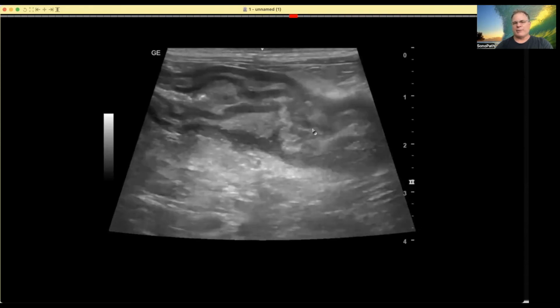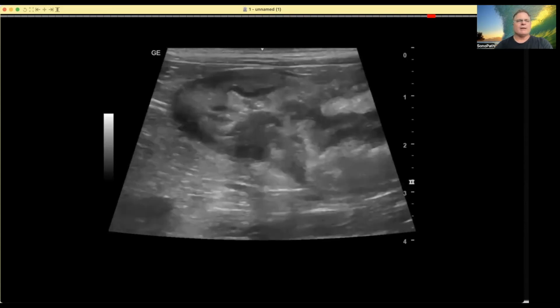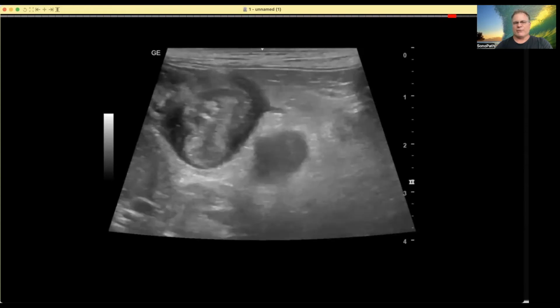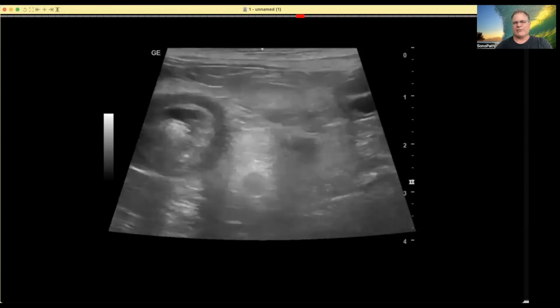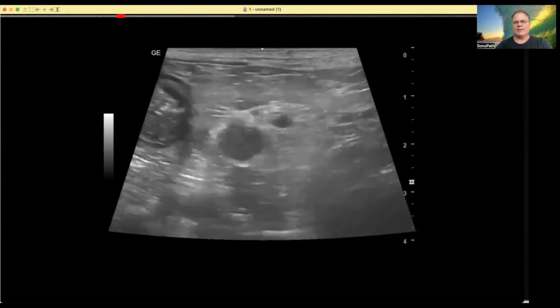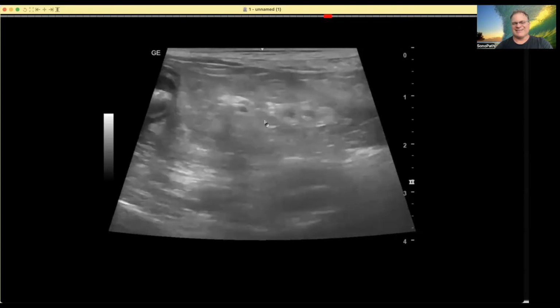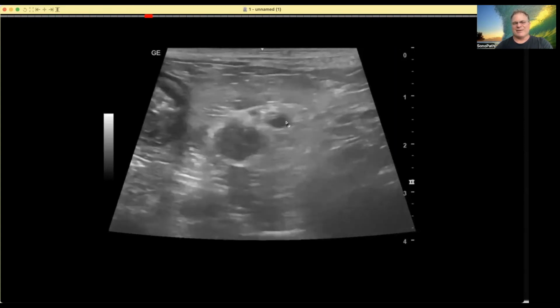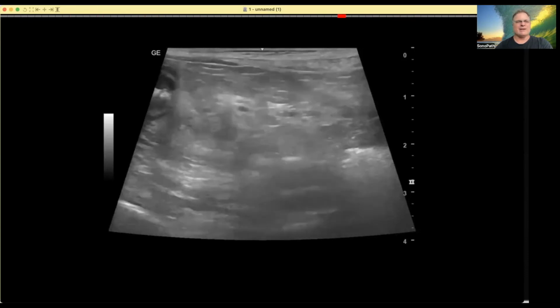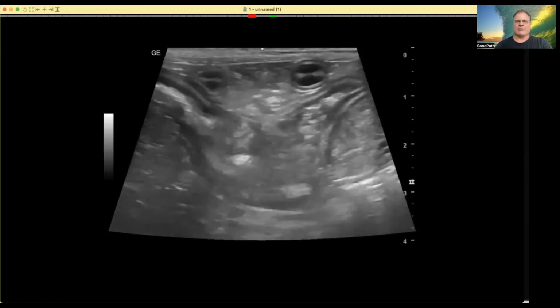Maybe it moved on through and it's elsewhere and created all of this havoc in the meantime. We don't know. There are a lot of things that can do this. Neoplasia is one. It's always in play here as we're reaching areas of neoplastic criteria, and definitely the lymph nodes are a suspect. This is a mesenteric artery, so don't stick that. It's a lot easier way to get a blood sample than sticking a mesenteric artery. Just make sure you angle away from that when you get into these lymph nodes or start doing aspirates in this area.